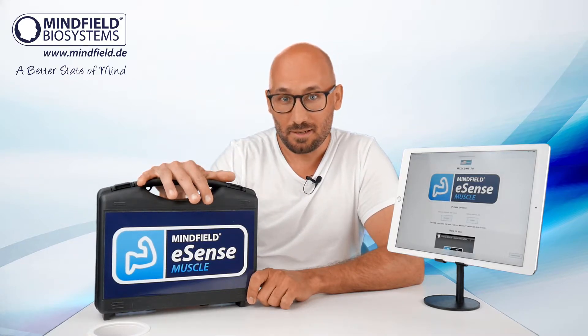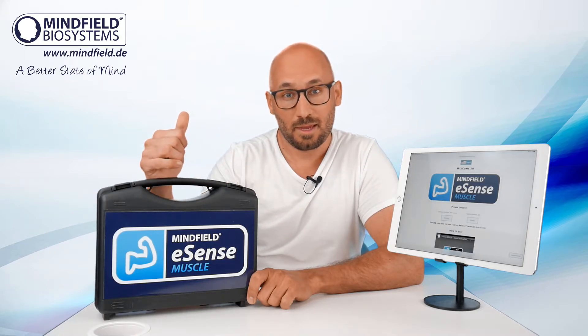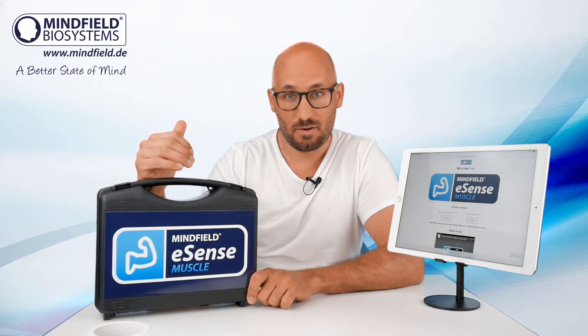The eSense muscle allows you to do muscle training, muscle strengthening, muscle relaxation, coordination training, and rehabilitation.